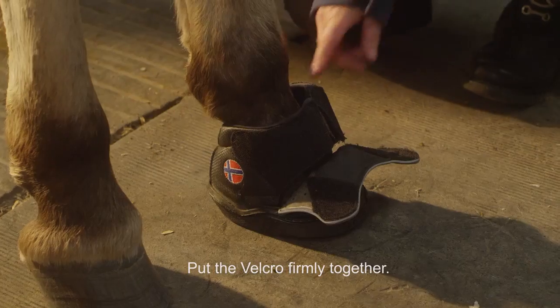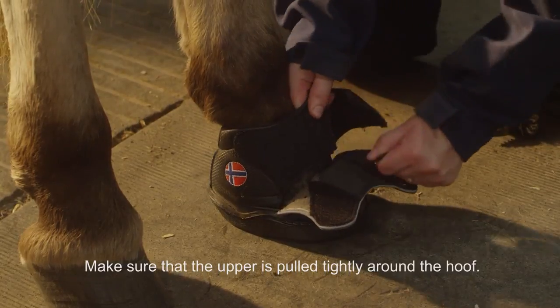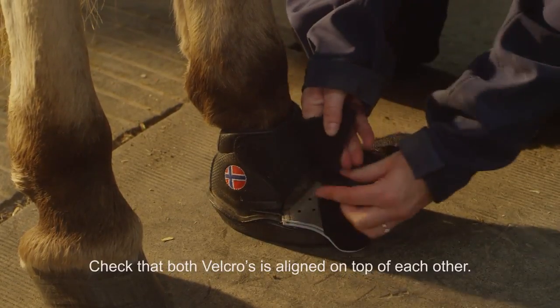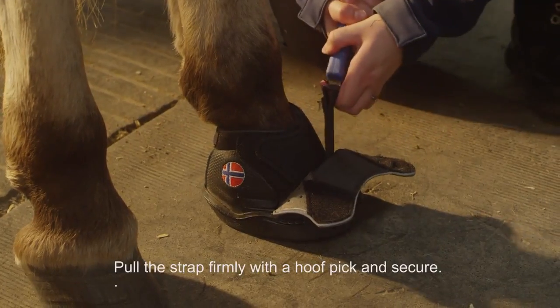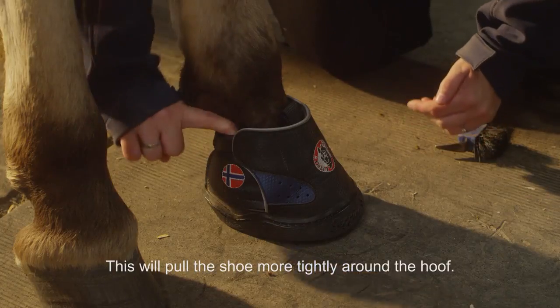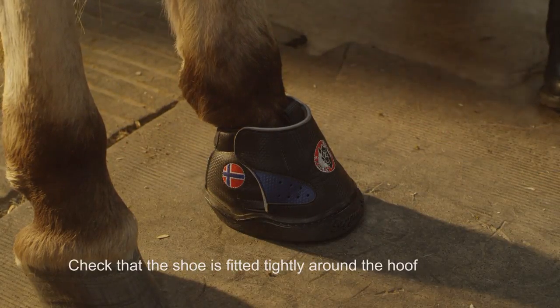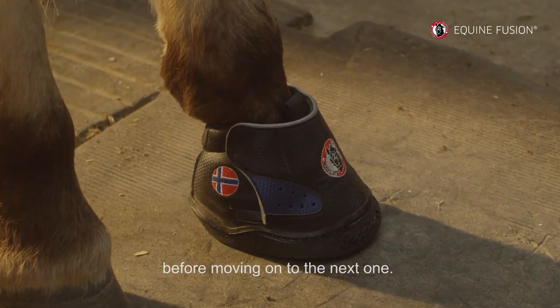Put the velcro firmly together. Make sure that the upper is pulled tightly around the hoof. Check that both velcros are aligned on top of each other. Pull the strap firmly with a hoof pick and secure. This will pull the shoe more tightly around the hoof. Check that the shoe is fitted tightly around the hoof before moving on to the next one.